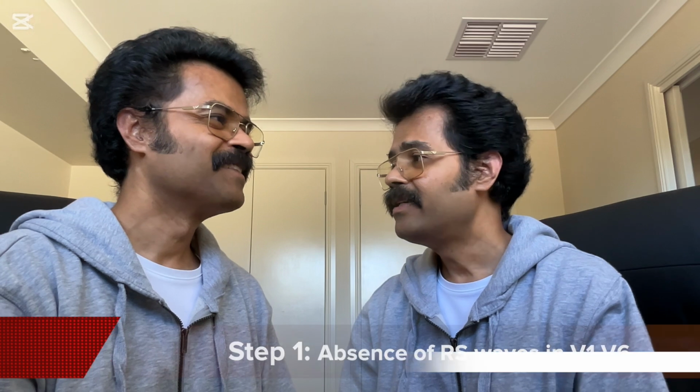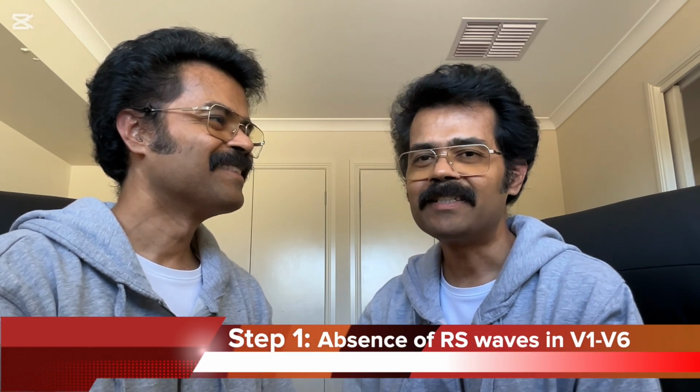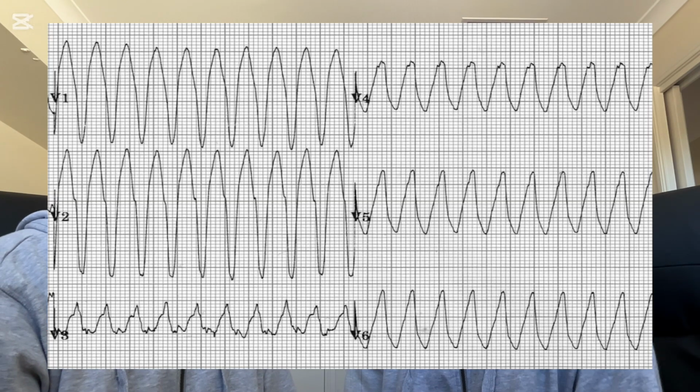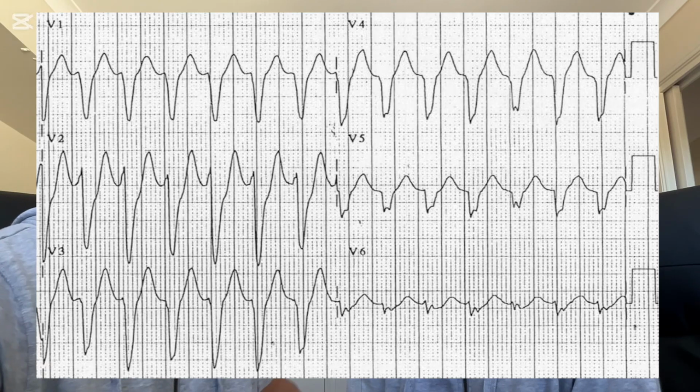The very first step is V1 to V6, looking for the concordance of the QRS complexes. What it necessarily means is, if there is only a positive deflection like an R wave, or a negative deflection like the Q or S wave in V1 to V6, we call this a positive concordance or negative concordance. If that is present, the specificity for VT is 98%. It is very likely to be VT.